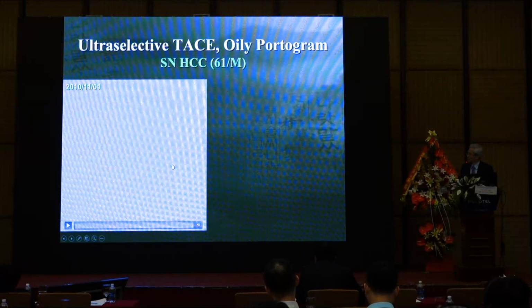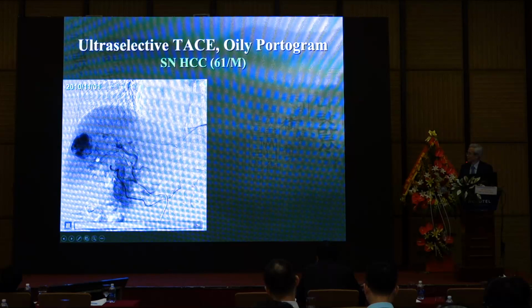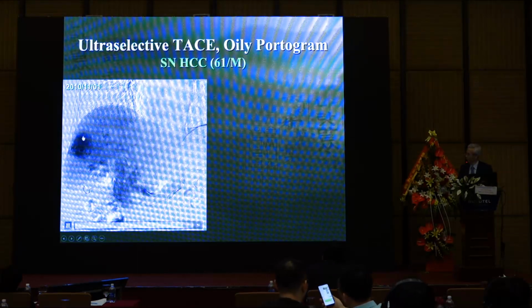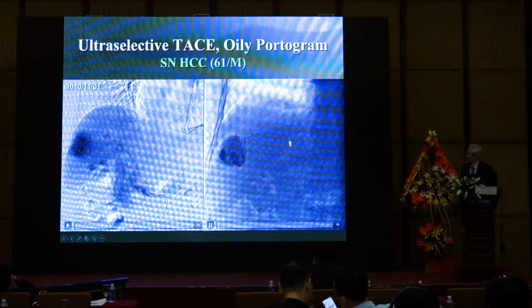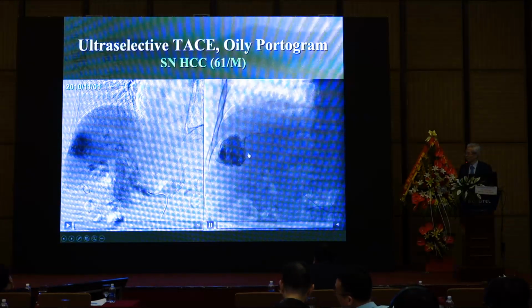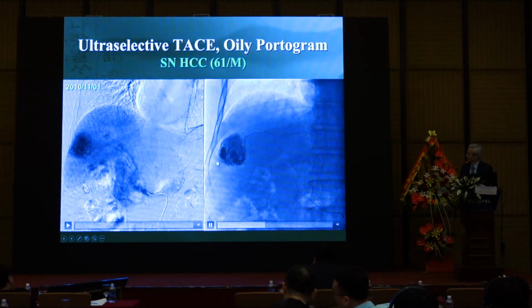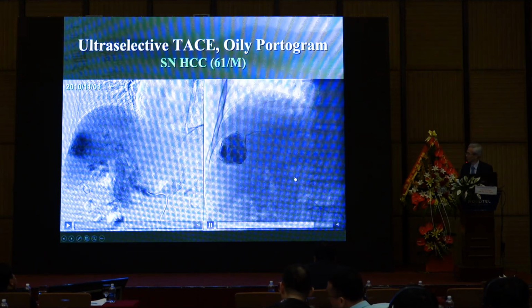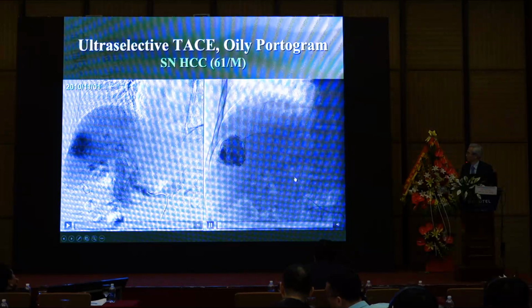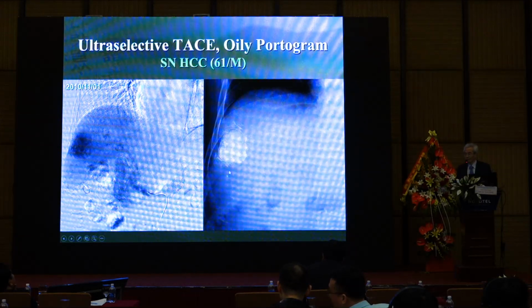Let me show you a clinical example. Here you can see a hypervascular tumor. First of all, you have to select the tumor feeding artery selectively. Never stop here. You have to continue to inject until the appearance of peritumoral portal vein with Lipiodol. And this is the ideal endpoint of conventional TACE.